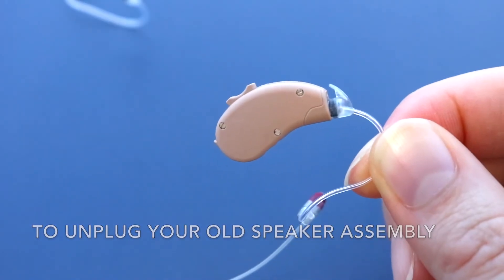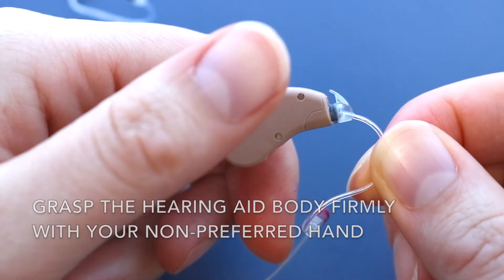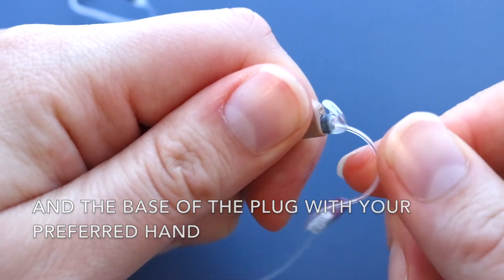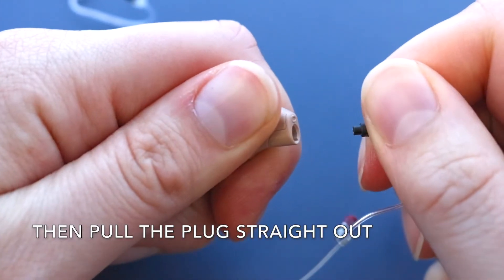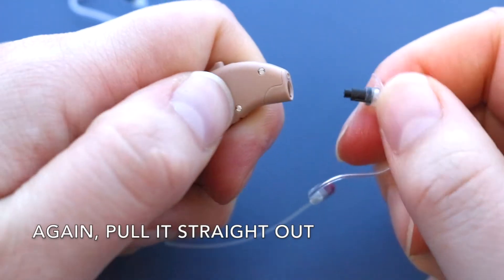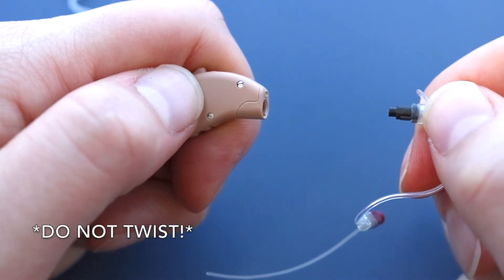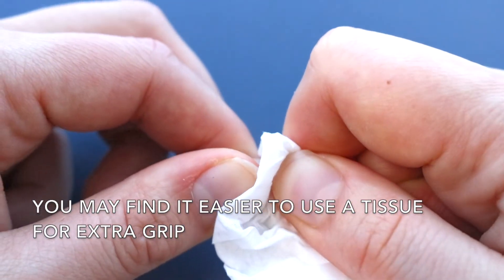To unplug your old speaker assembly, grasp the hearing aid body firmly with your non-preferred hand and the base of the plug with your preferred hand. Then pull the plug straight out. Do not twist. You may find it easier to use a tissue for extra grip.